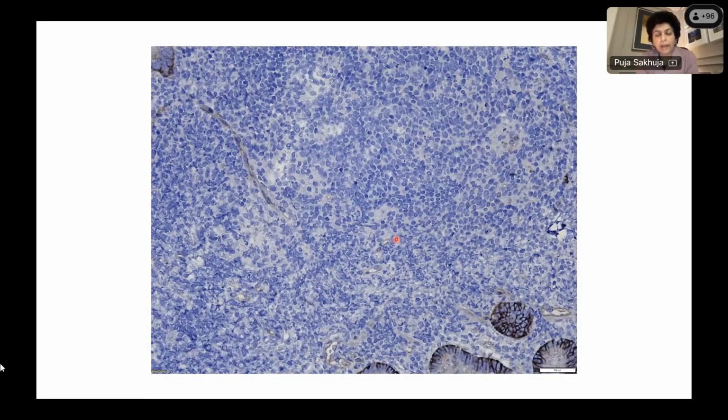What are we trying to look for? Giardia we have seen. You said that you did not see any plasma cells. So we are going to try and look for plasma cells and make sure that we are not seeing them.